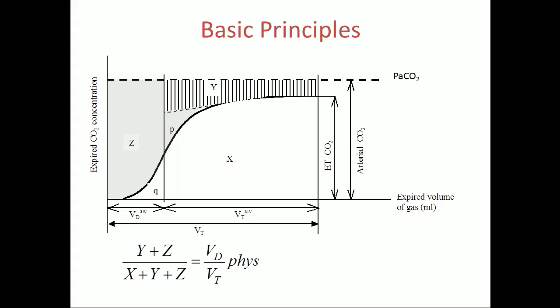So the good news is, and there is good news, that if you enter your arterial PCO2 value, most of the machines that have the capacity to measure volumetric capnography do these calculations for you. But I thought it'd be good to just go through it.